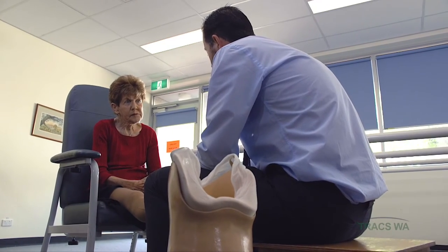A stump shrinker is a compression garment for a stump after amputation. It works much like a compression garment for a leg, but shaped after an amputation. They're first applied after an amputation when sutures or stitches are out and healing is underway — sometimes 10 to 14 days after amputation. It's applied to reduce the post-operative swelling or edema of a stump and to start to reduce the shape of the stump in preparation for prosthetic castings.